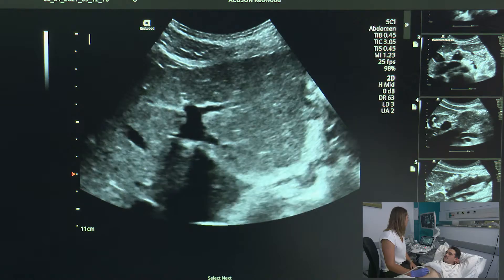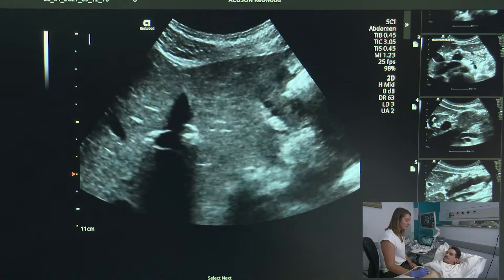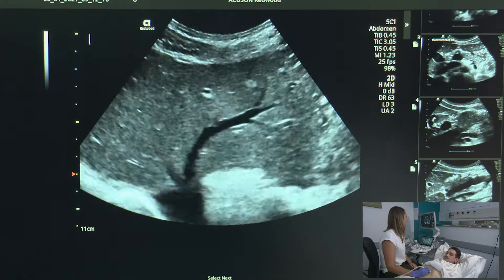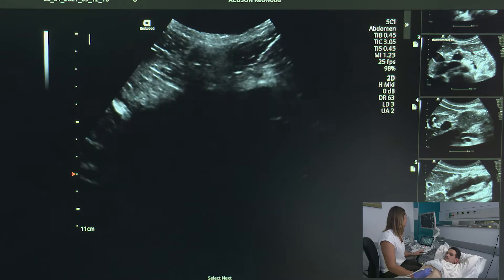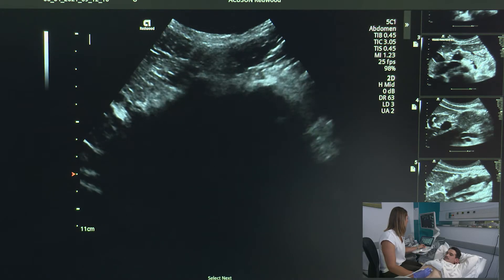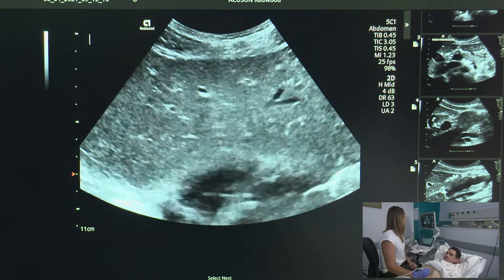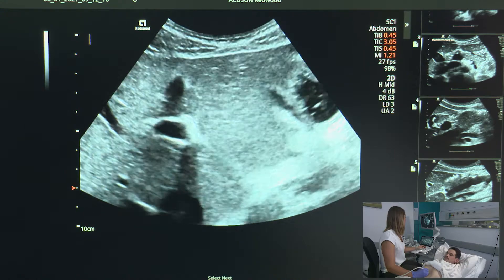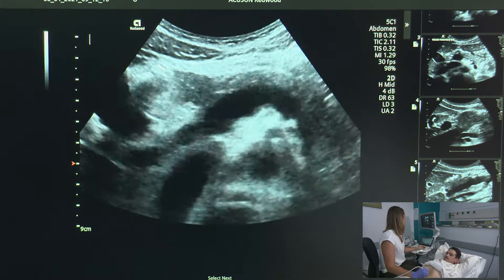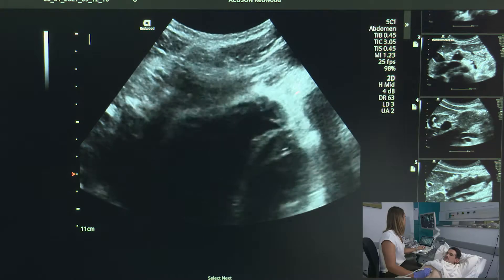I've found my liver and I'm first going to scan just the left lobe. Big breath in for me, Bruce. I'm going to sweep all the way, angling towards the heart, and now I'm going to start sweeping down. I'm not so worried about catching that lateral border of the left lobe. I'll adjust my depth as I scan and come back up all the way out to where I started. Breathe.